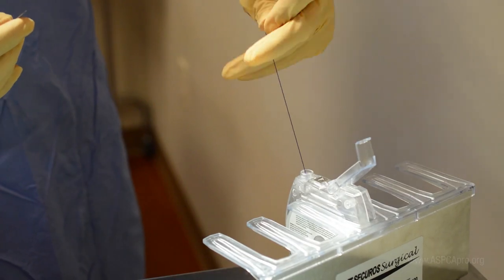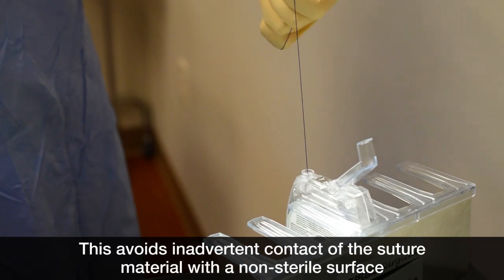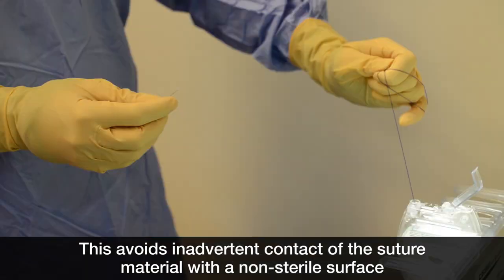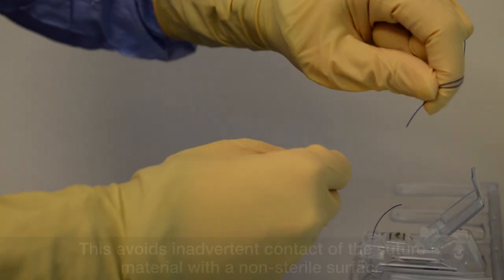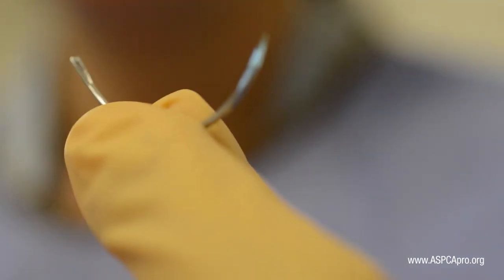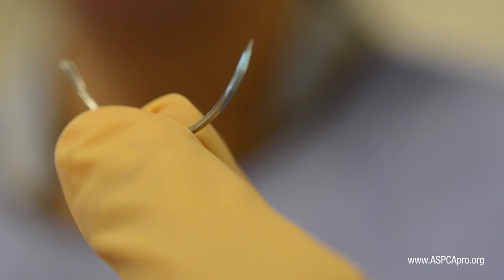Wrap the desired amount of suture around your hand as you retrieve it from the cassette. Then cut it with a blade or needle holders, still maintaining control. Hold the selected needle in your non-dominant hand with the needle curving away from your hand.